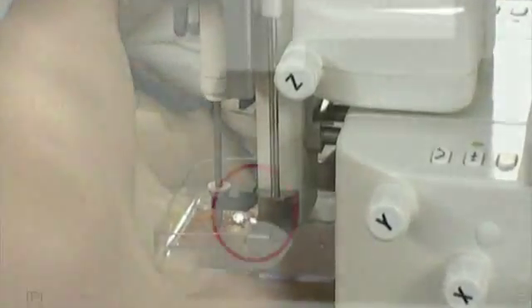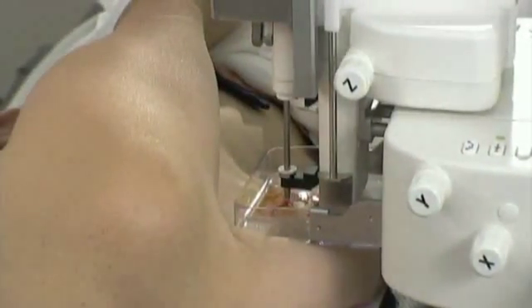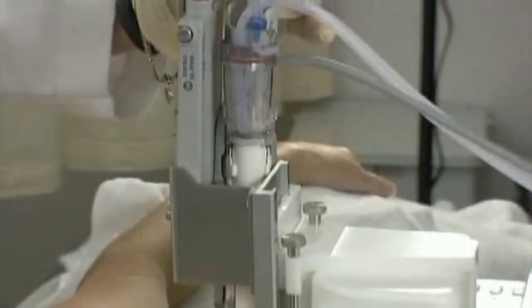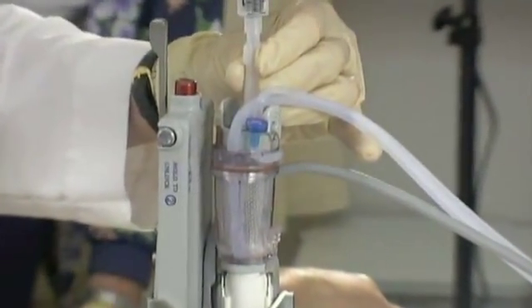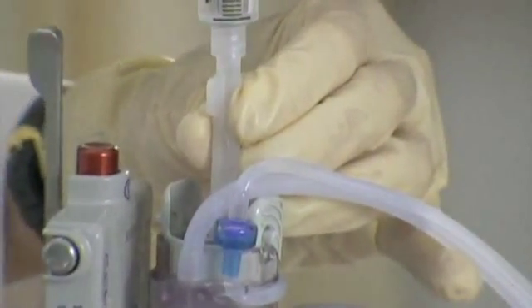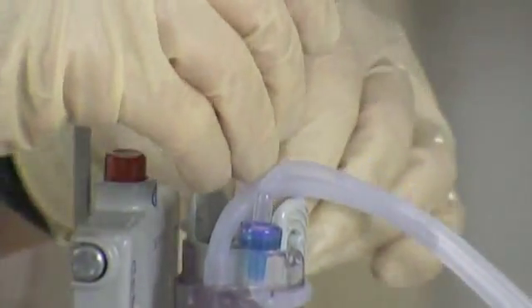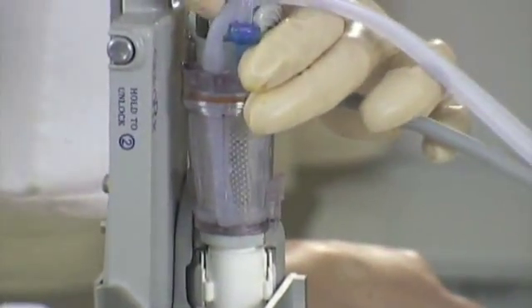We're going to take a couple of stereo pictures. Next, I'm going to deliver some anesthetic through the needle that's already there. That's done easily with the Centrex needle by marrying the syringe with the introducer into the biopsy device. I'm delivering some local anesthetic — it's going right to the area where we're going to take the biopsy samples so that you won't feel anything. I'll close up our system so that we can apply vacuum, and we're ready to rock and roll.